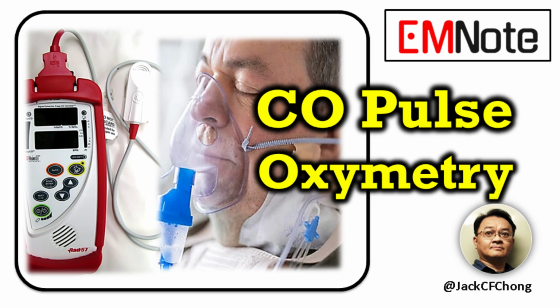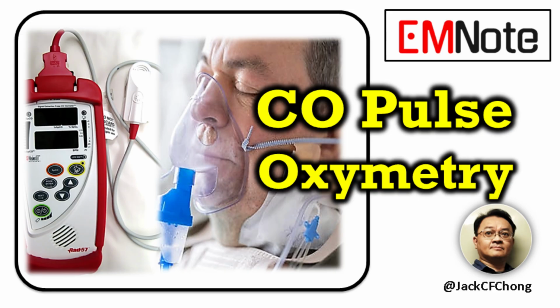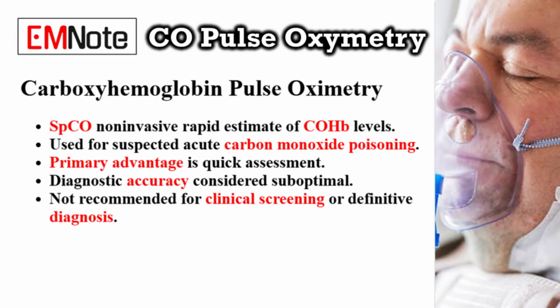Carboxyhemoglobin pulse oximetry in carbon monoxide poisoning. Carbon monoxide pulse oximetry, or SpCO, is a non-invasive technique designed to rapidly estimate carboxyhemoglobin, or COHb, levels in patients suspected of acute carbon monoxide poisoning. This method offers a quick assessment, which is one of its primary advantages.